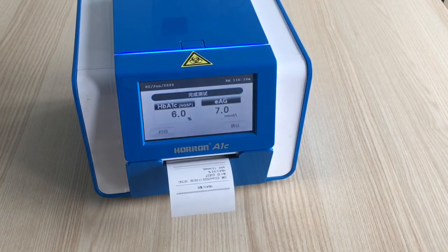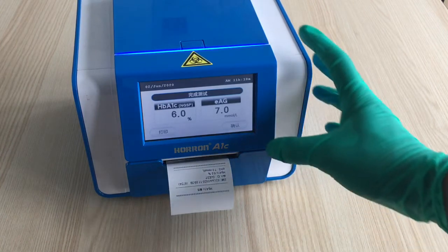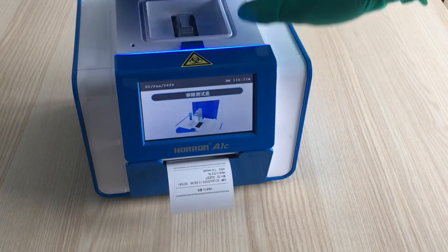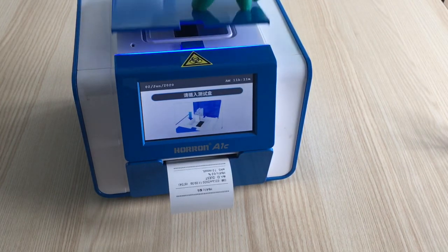Here it shows the two results. The left side is the HbA1c and the right side is the eAG. Test finished.